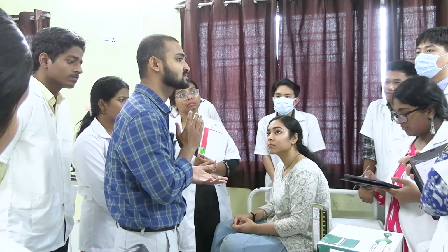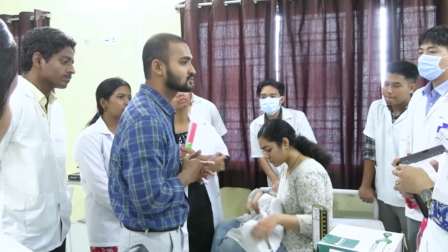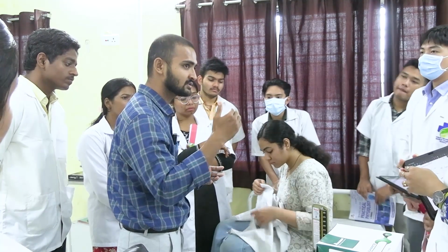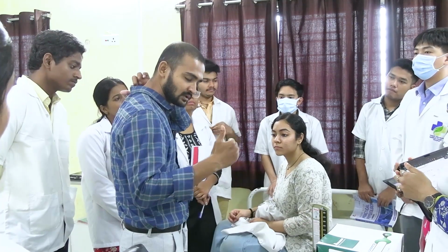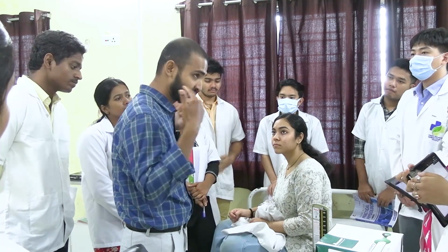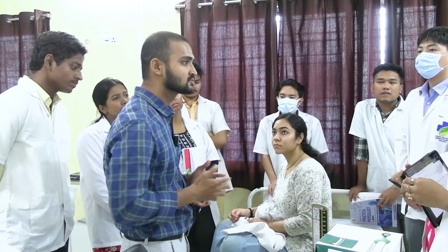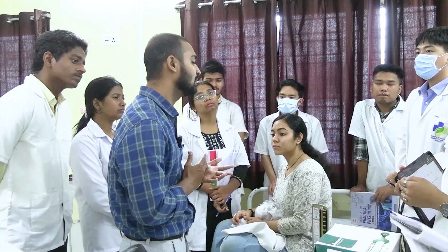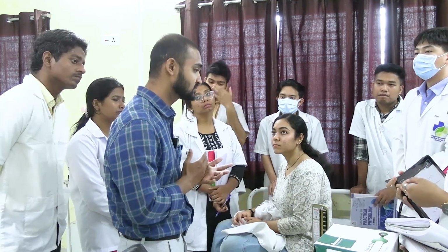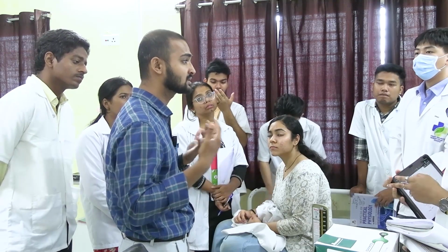Suppose his BP is 280. So you have raised till 200. So when you start from the 200, you will be getting the beat, and at a certain point, if you measure through auscultatory, the beat will diminish or be silent. So if you use this palpatory method, the first beat or palpation which you get at the highest level, you can get the idea. So it helps during measurement by the auscultatory method.